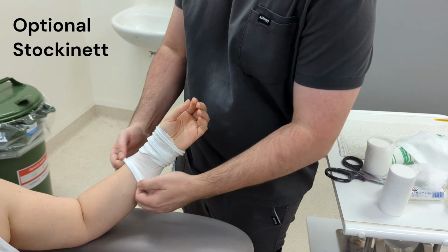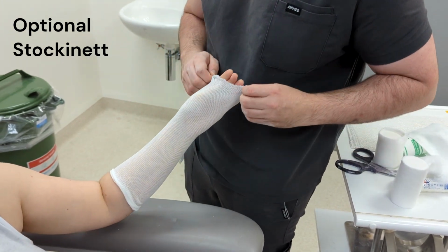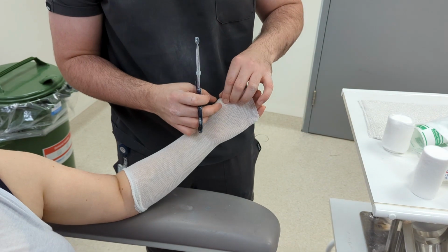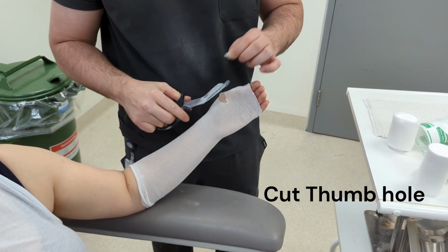An optional layer is to add something called a stockinette. This allows an extra layer of skin protection for the patient, as well as mild compression. When doing this, it is important to add extra length than the originally measured cast. This allows for tidying up of the cast later on, as you will see.